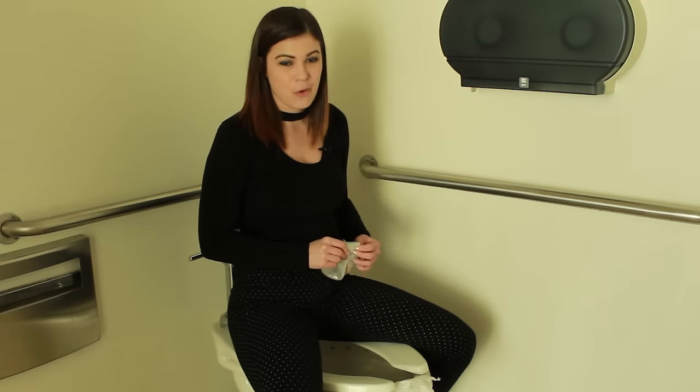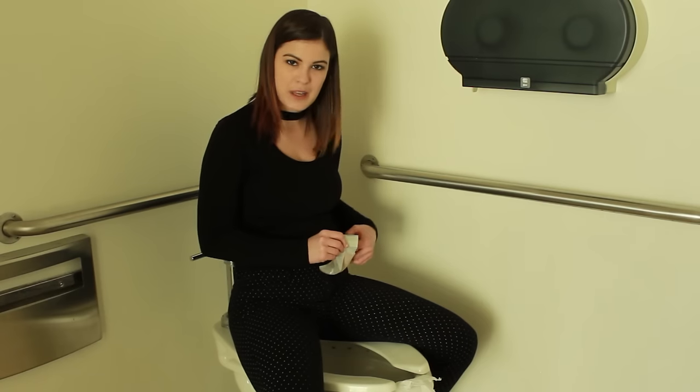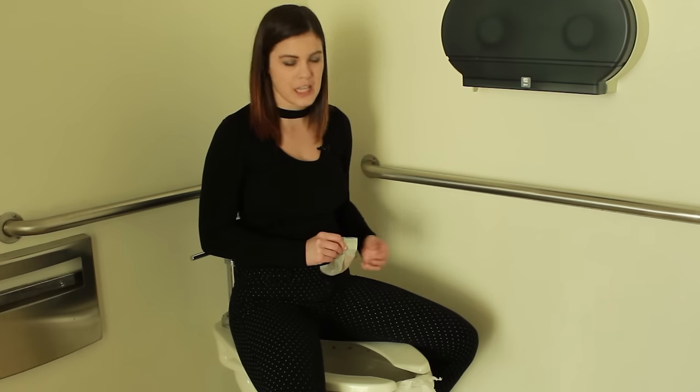It's important to note that we're using water as a substitute for any output or stool that would usually be in the pouch, so it's more liquidy than it usually would be.